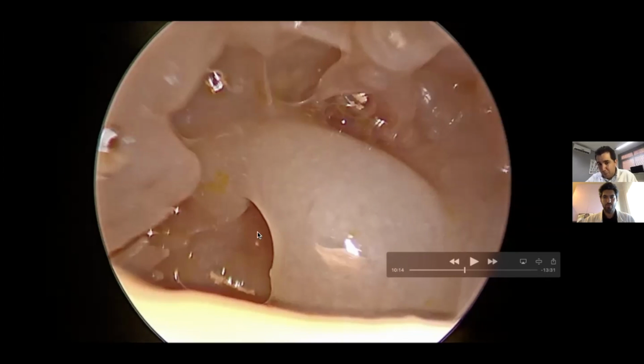So it's very good for cochlear implantation, and the guys who perform implantation know this anatomy very well. This is a very nice thing I call the tip of the iceberg. It's the projection of the styloid prominence, the styloid process. So this is the styloid prominence, the anatomical name. This is the pyramidal eminence, and this is the subpyramidal space below the pyramidal eminence.